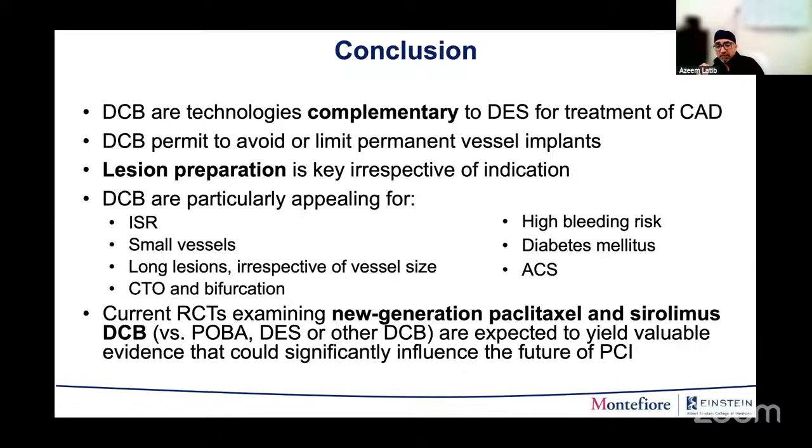And I would be very supportive of us using drug-coated balloons only in those patients and not putting another stent in. But I would want it done in a very controlled way where we collect the data and we reanalyze and we look at it a year from now, right? After we've done 20, 30 patients and see, is it valuable or not? I'm not in favor of just doing things and not collecting the data. I think you have to collect the data and do it properly.